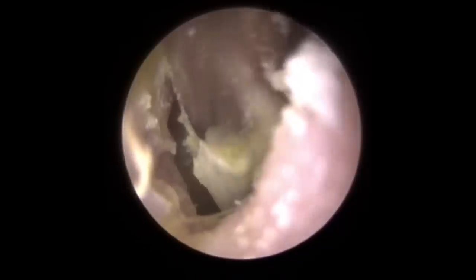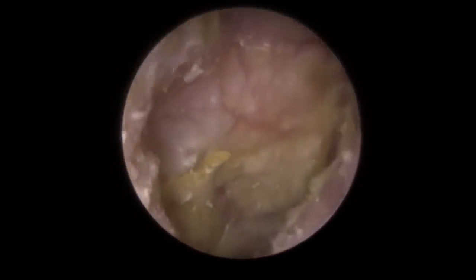If we can suck a lot of this into the end of the suction tube, we can get a really good grip and take it out the bottom of that valley. Making circular movements, moving around, pulling left to right, up, down, loosening this from that valley. There we go — starting to come away. There it goes — all sucked into the suction tube. Okay, so we've got rid of it.